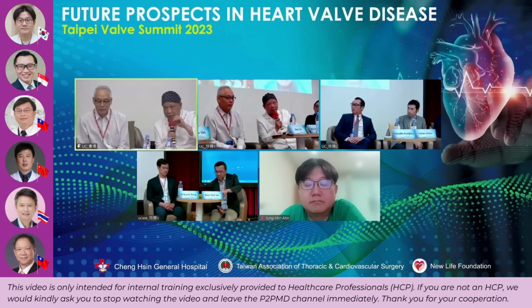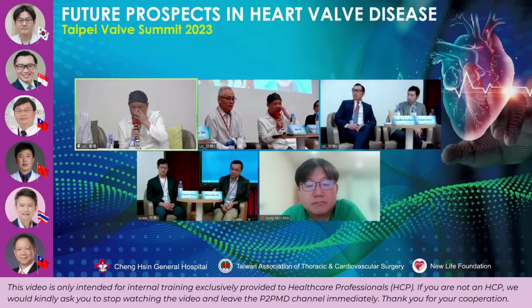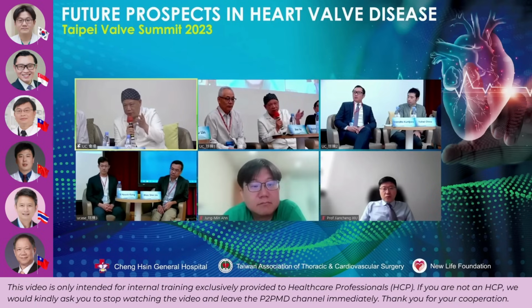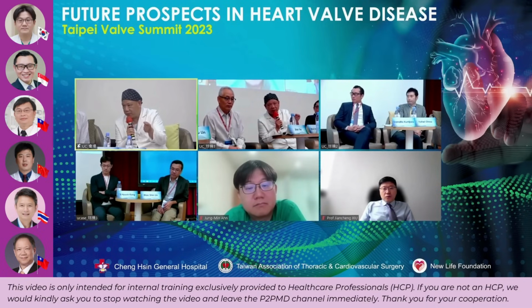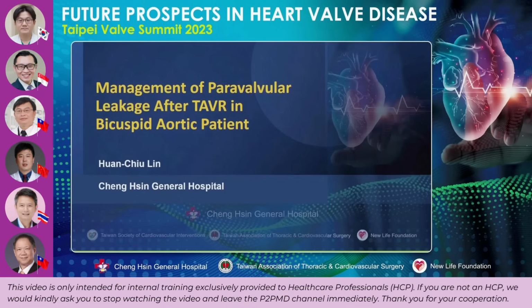I think today's case is a very good demonstration of using a self-expanding valve for aortic regurgitation. Usually we don't use self-expanding or balloon expandable valves for aortic regurgitation because of the lack of calcium for anchoring. But in this particular case, because she has calcium and a fibrotic band, we used that as an anchor.